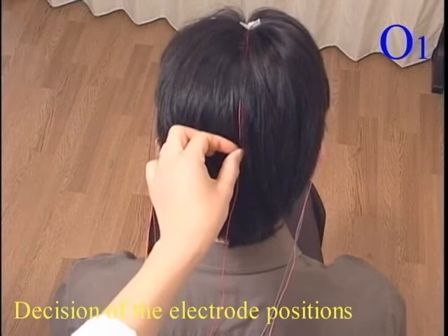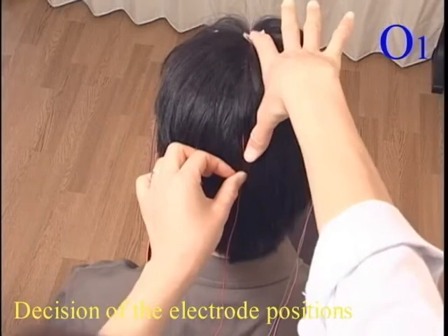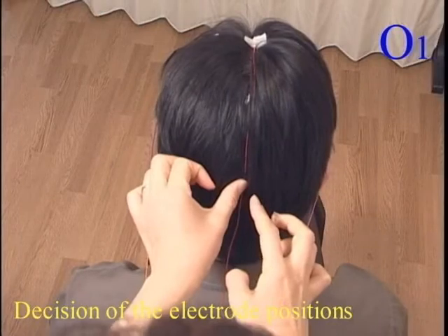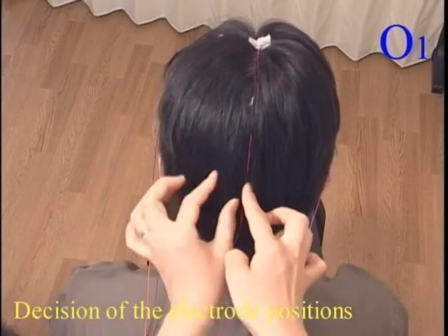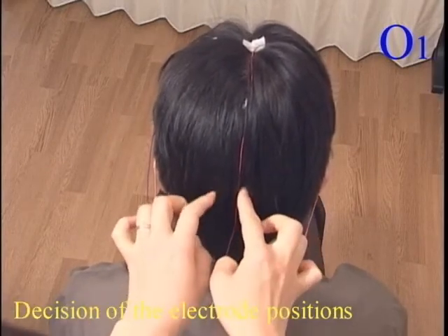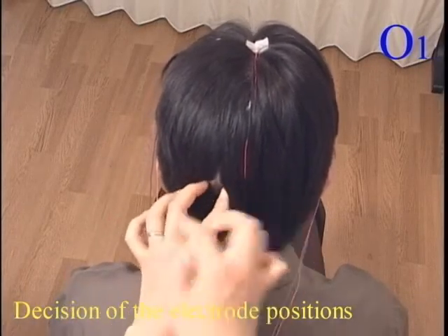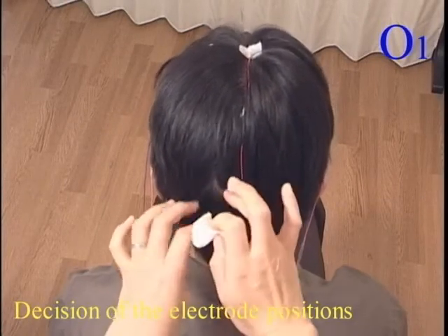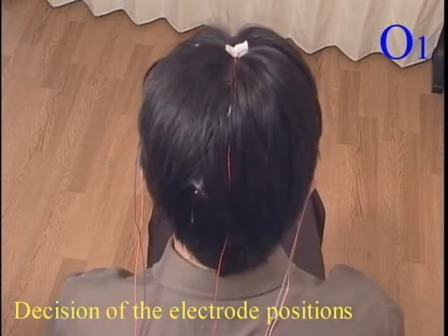Next, hang a lead line from CZ straight down to pass through the inion. Mark the 1/5 point from the inion as OZ, but do not attach any electrode. Join OZ to T3 and mark the 1/5 point from OZ as O1. Decide O2 position by the same procedure.